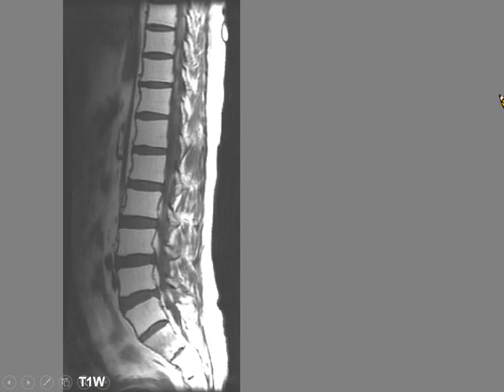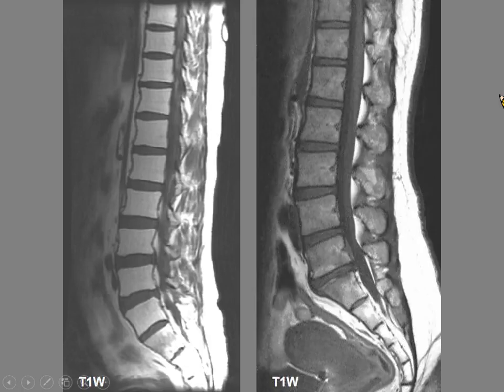Well, I think this is best appreciated if you put them alongside each other. And you can see that in a patient with disorders of marrow depletion, it has a higher T1 weighted signal and it has a more homogeneous appearance compared to the marrow in a normal aging patient.